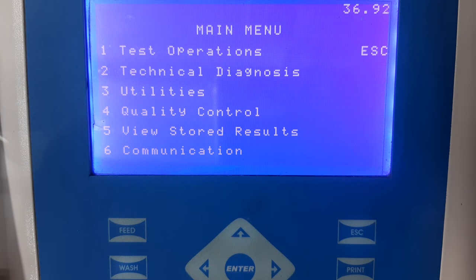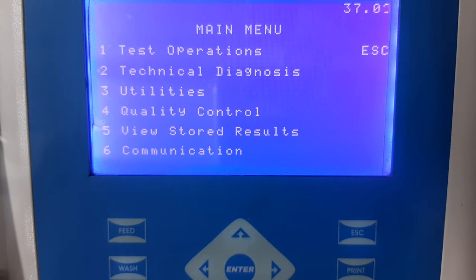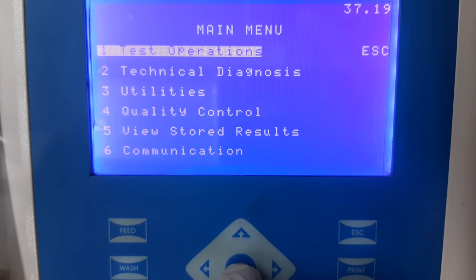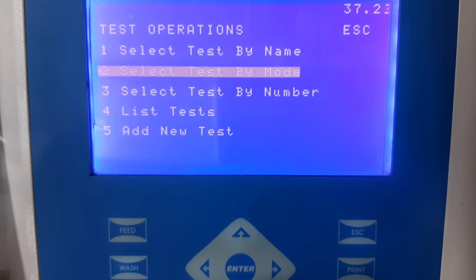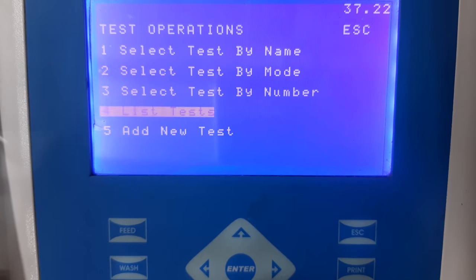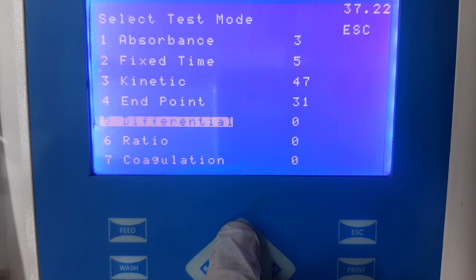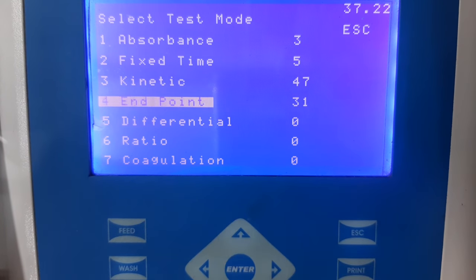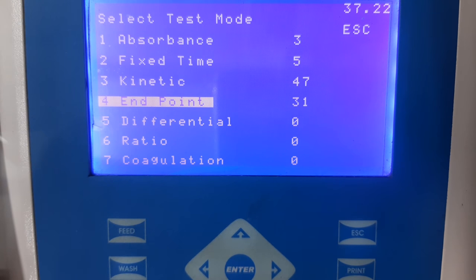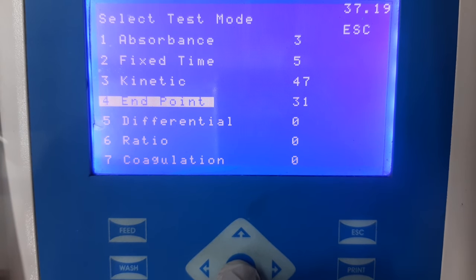The first thing that needs to be done is switch on the instrument and come to the main menu. Once you are at the main menu, select test operations and then select add new test. Here, multiple options are available to select the mode. We have to select endpoint mode because potassium is an endpoint parameter.